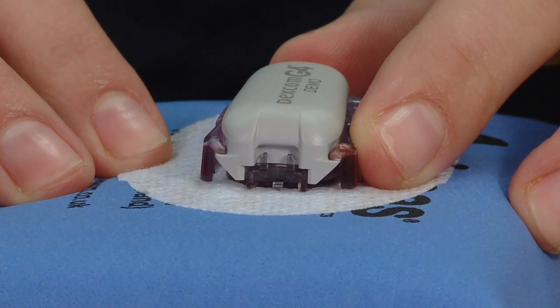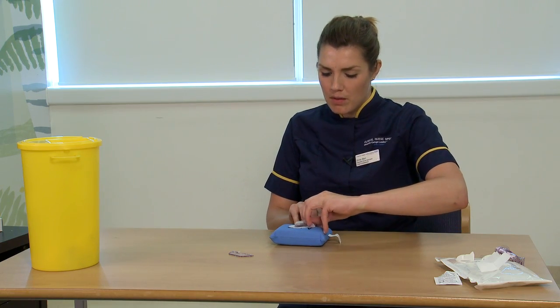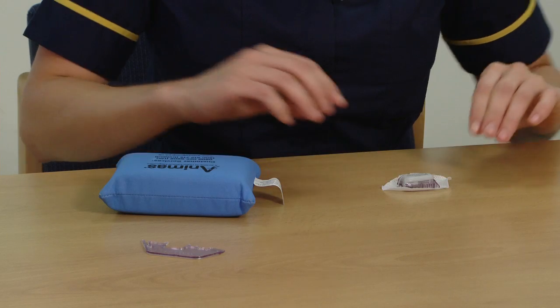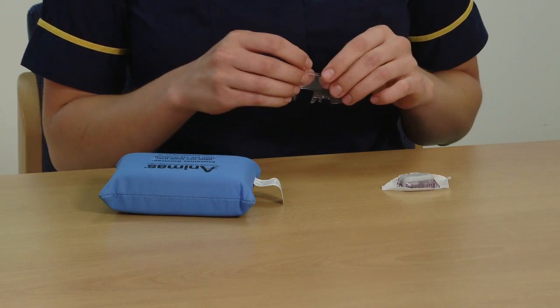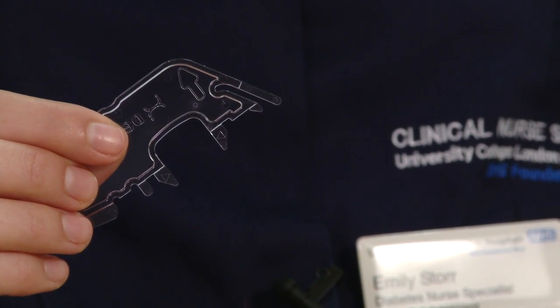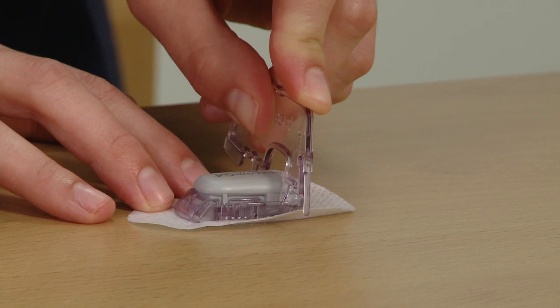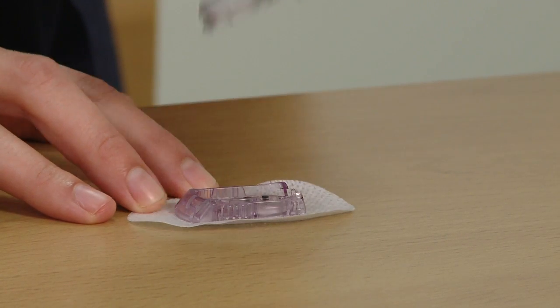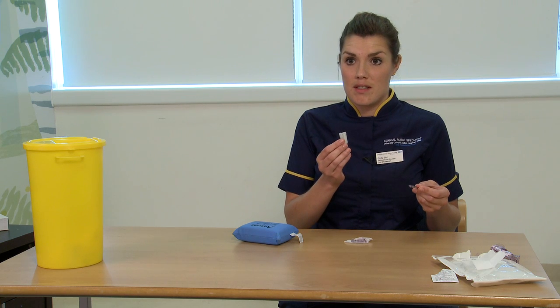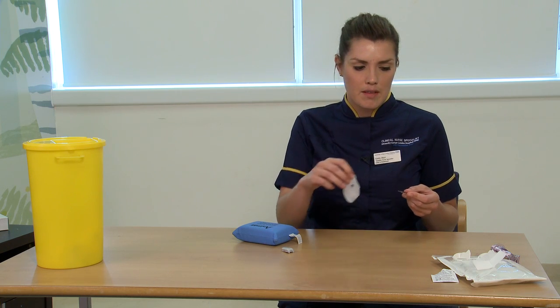The sensor lasts for seven days. At the end of the seven days, simply peel the transmitter away from the skin like a plaster and place it on the table. To remove the transmitter from the plaster, you'll need your safety guard again. Place this on the wide end of the transmitter and push down firmly to release the transmitter from the sensor. You'll need to save the transmitter as you'll need it for your next sensor. The sensor plaster can then be discarded.